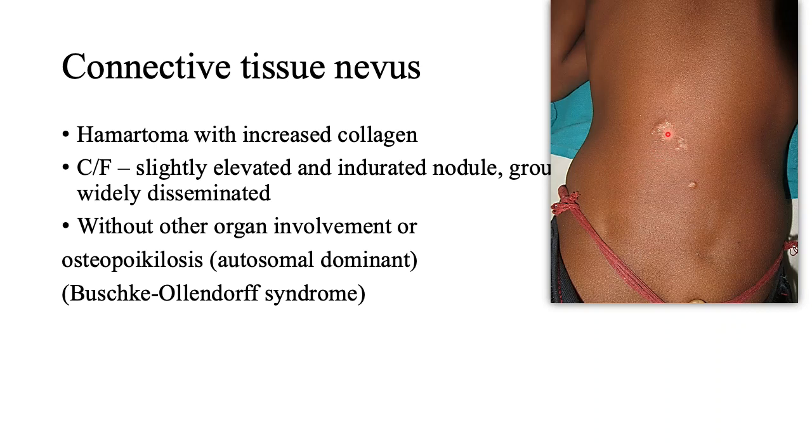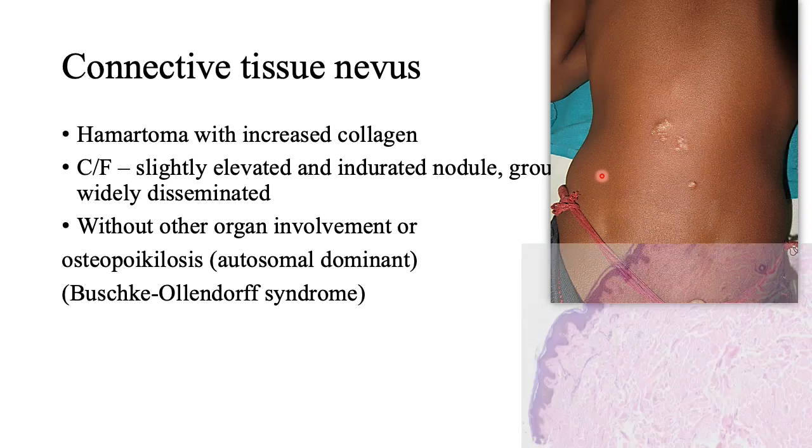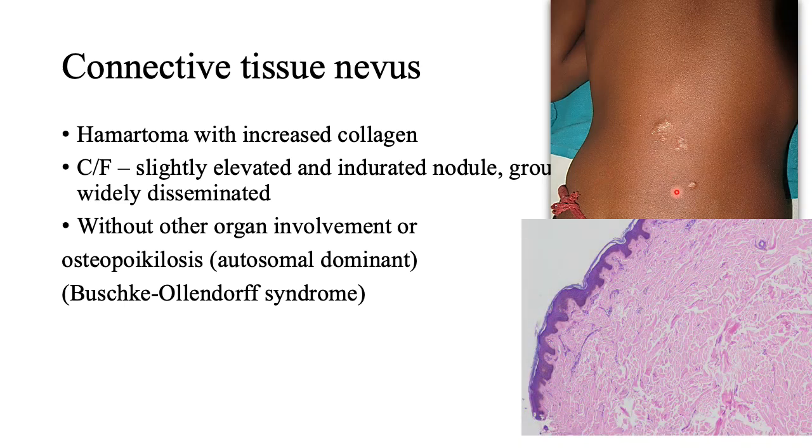This is the clinical picture of connective tissue nevus. These are the skin nodules. And in microscopy, this is very difficult to diagnose. If it is compared with the normal skin, we will see an increased amount of collagen in the dermis.